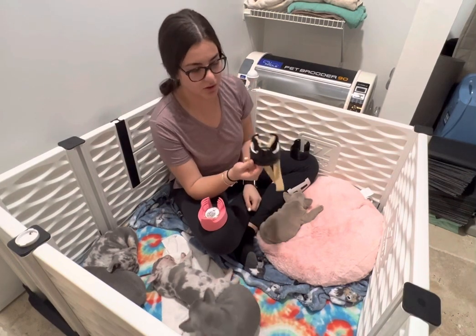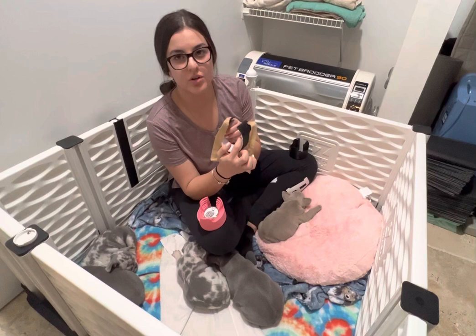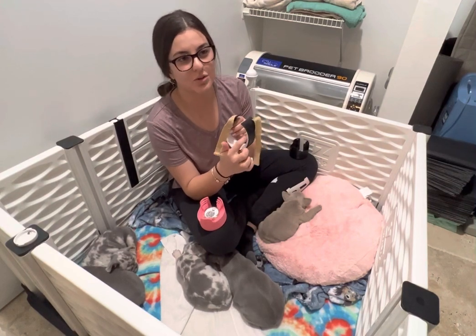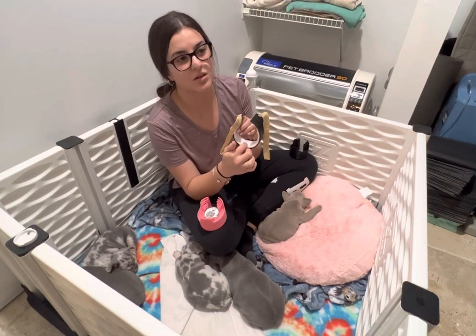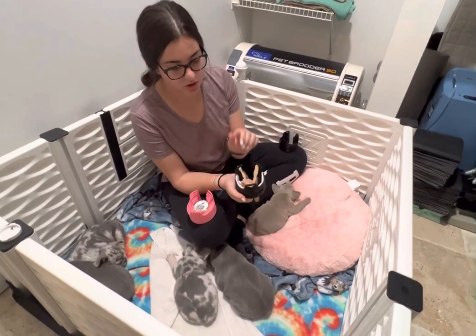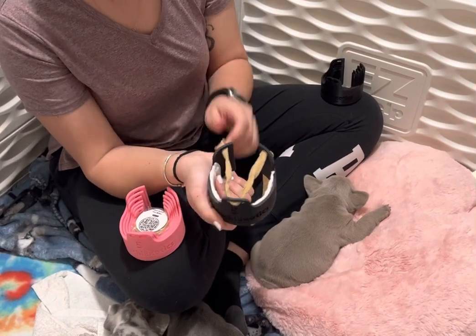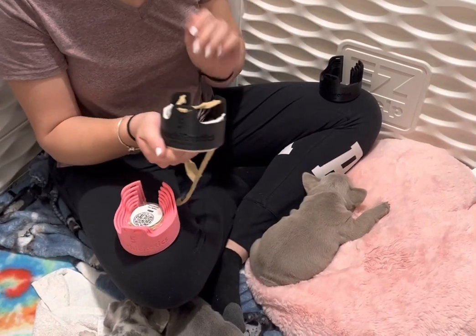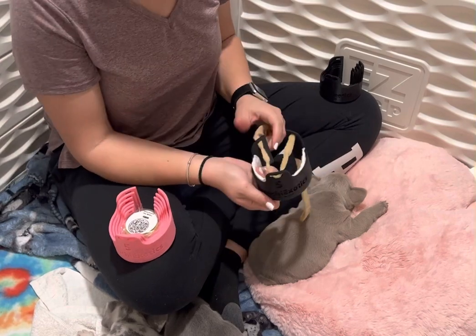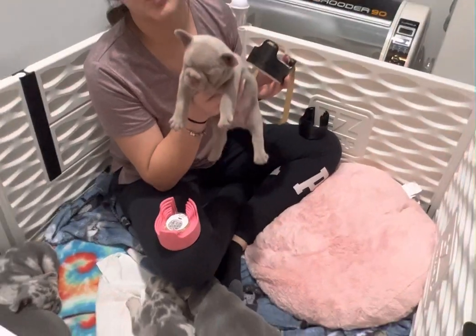For demonstrational purposes we already have one set up. You want to line the interior with a pad liner or something that's soft and replaceable after it gets dirty. You'll want to run your self-adhesive tape through the front and out the back ends. This is a size five and I'm going to demonstrate how to insert a puppy into it. This is our five and a half week old puppy.